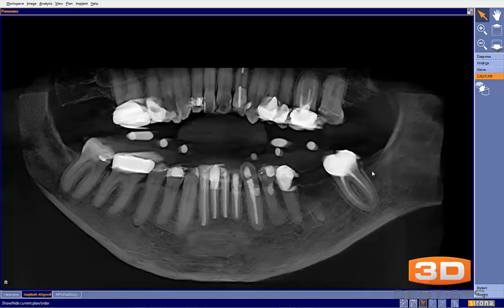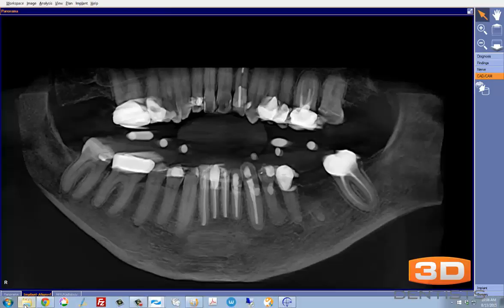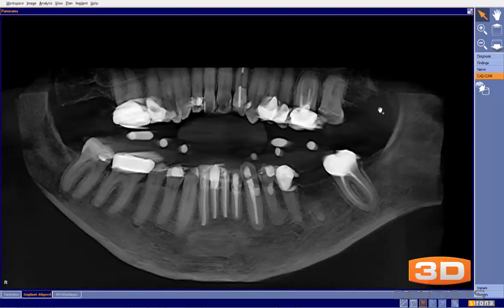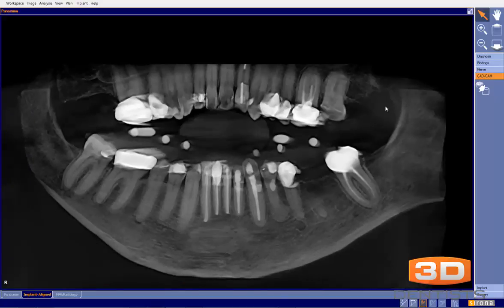Let's start by talking about the classic scan versus the OptiGuide scan. Looking at this scan, I do agree that the safe bet in a situation like this is to do a classic guide. Here you can see the classic guide and the fiduciary markers in the scan. This classic guide is a pre-made bite plate with fiduciary markers that you reline with bite registration material in the situation of a dentate patient, and then you take the scan with that in the mouth. The classic guide is used in scenarios of extreme scatter — typically from circumferential restorations, which would not allow our CAD-CAM data to integrate properly. So this was a good call.